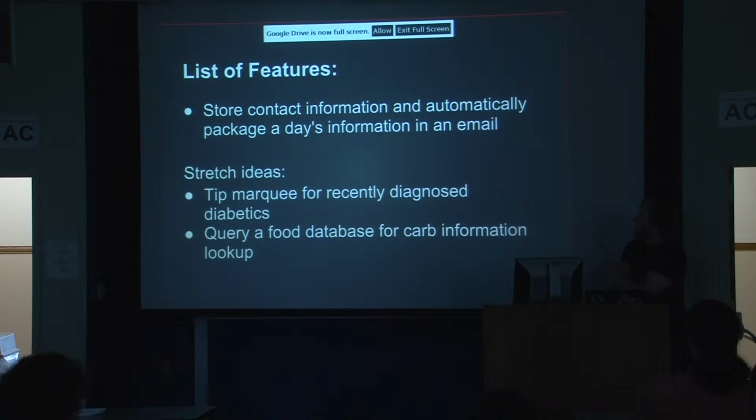And one of the coolest things I want to do with it is you can store all of the data that it takes in a day and automatically email it to someone, if you have an endocrinologist that you want to know about your progress or whatever.